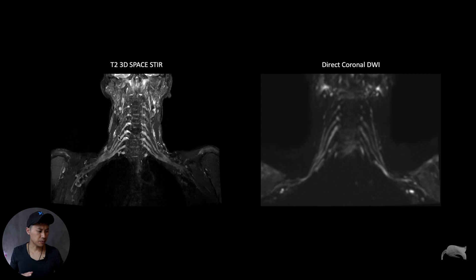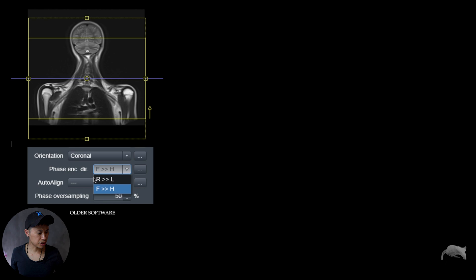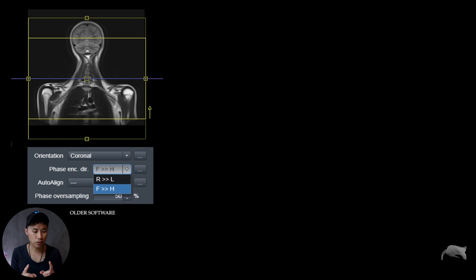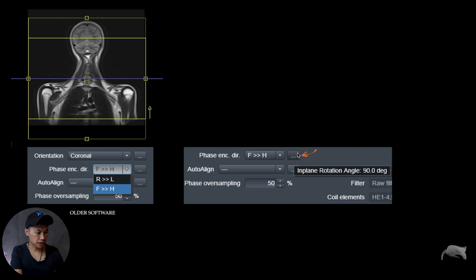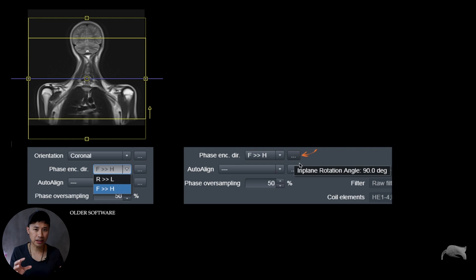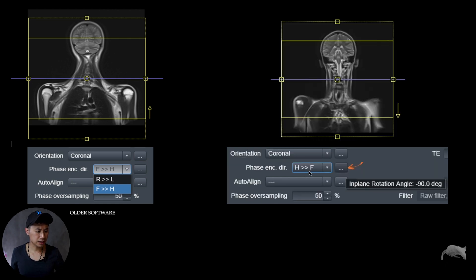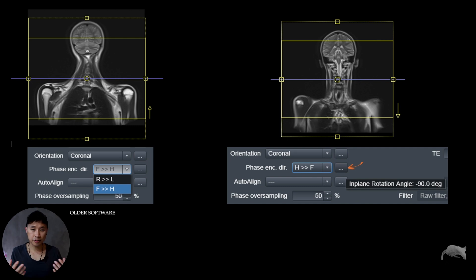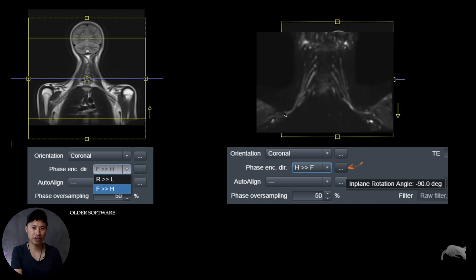It's more like the T2 morphologic images — the nerves look great. However, on the older software it's also possible. If you go to the phase encoding direction, you only have two options: right-left or feet-head, no other options. However, there is a workaround. If you hover your mouse, you can see it says in-plane rotation 90 degrees. If you push that button, you can go in and manually rewrite minus 90 degrees. Doing minus 90 degrees automatically changes this to head-feet, and it still works. Keep that in mind on the older software to get results like that.